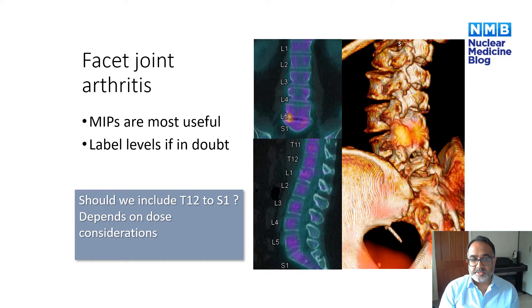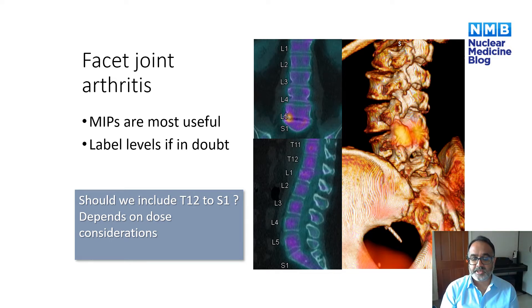When deciding which joints to target on the SPECT CT, I find that the MIP images — the maximum intensity projection images — are the most useful. As a general rule of thumb, it's quite useful to label the levels, as we've done here on these images, so that avoids any doubt as to which level you're talking about when writing the report.